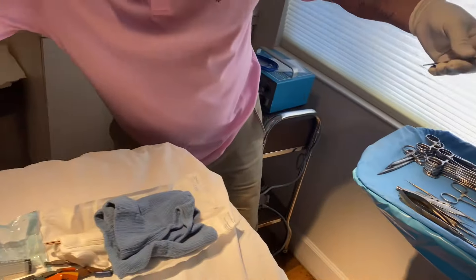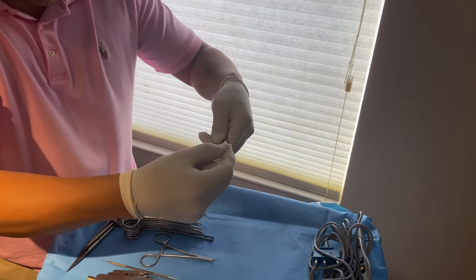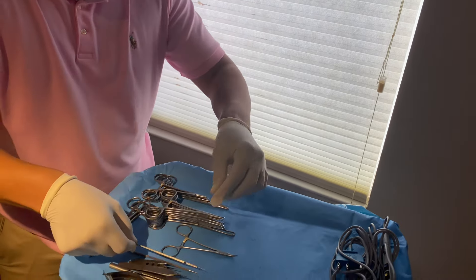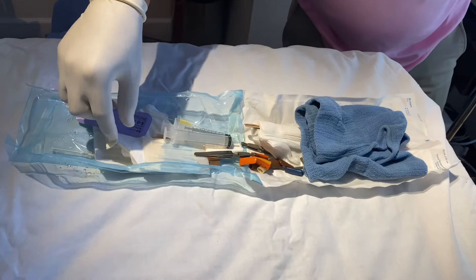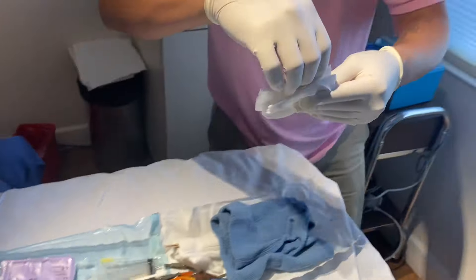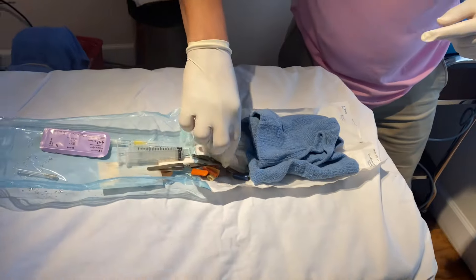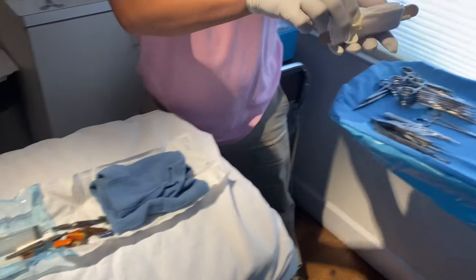Then the little blade — slide it in there. Just be careful: this thing is very sharp; I've already cut myself. And then we grab the gauzes — these are all sterile. You can never have enough gauzes, but for the most part there's a total of about ten gauzes.